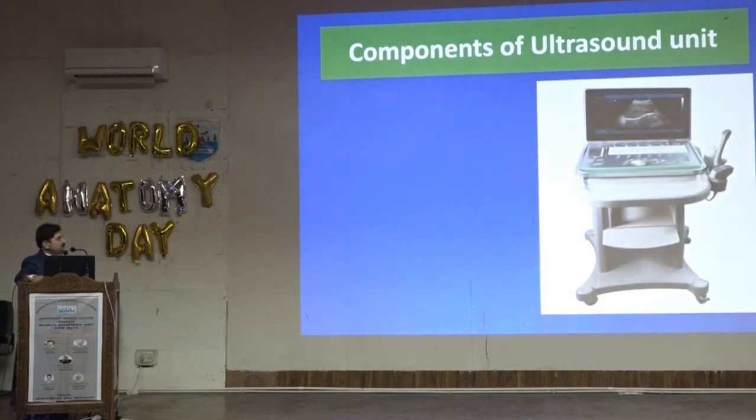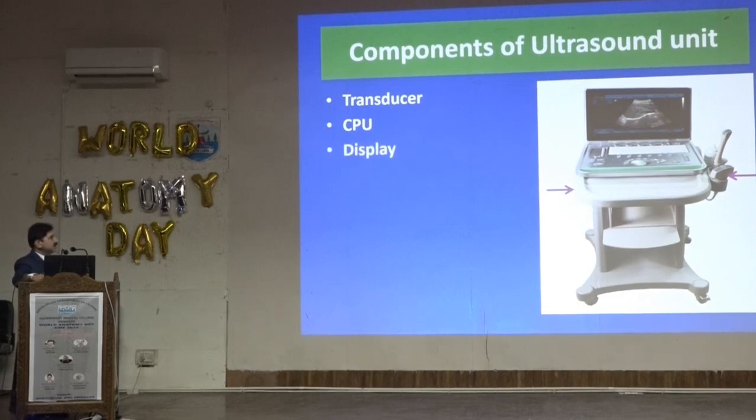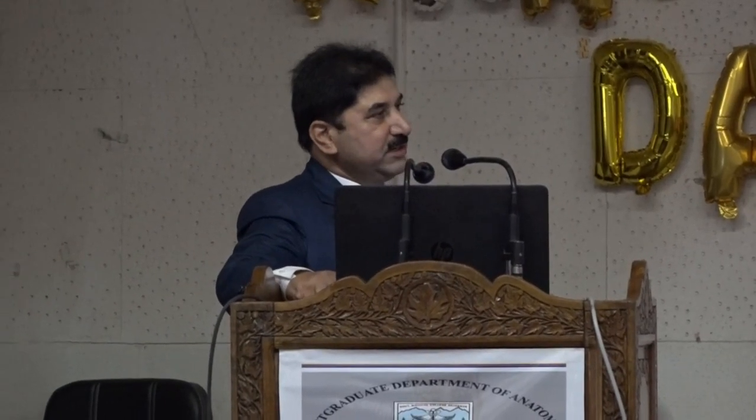If we talk about the generation of the ultrasound waves, we need a transducer which converts one form of energy into another, that is electrical energy, into the signals. A central processing unit like a computer which processes these waves. A display or a screen which displays the image. A keyboard for manipulation. Coupling gel which is used at the interface between skin and tissues.